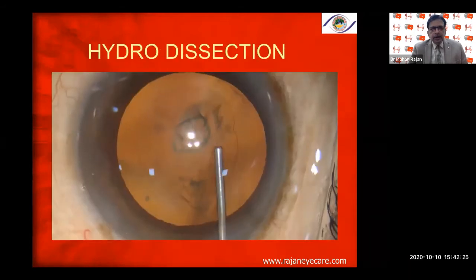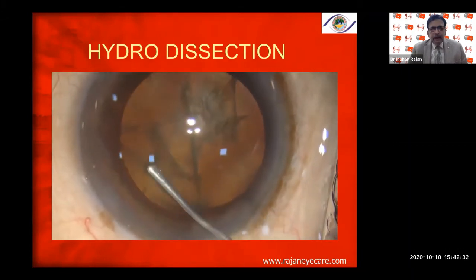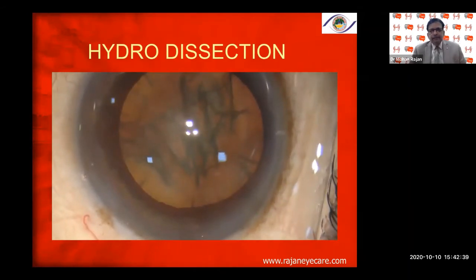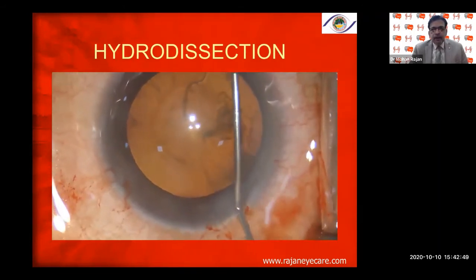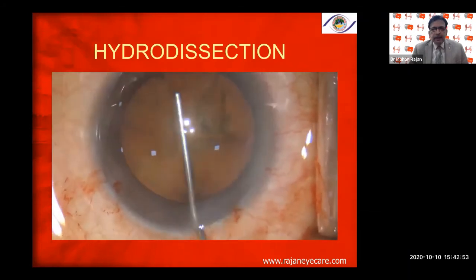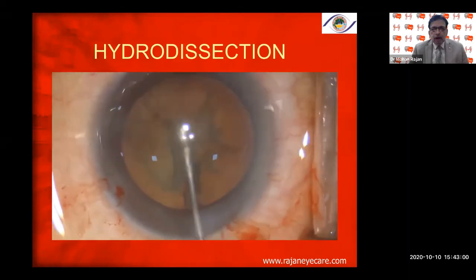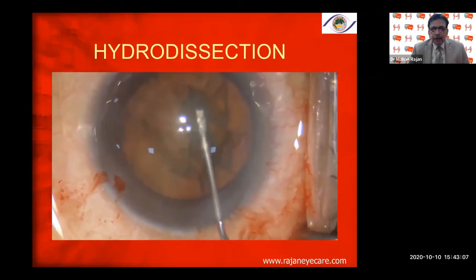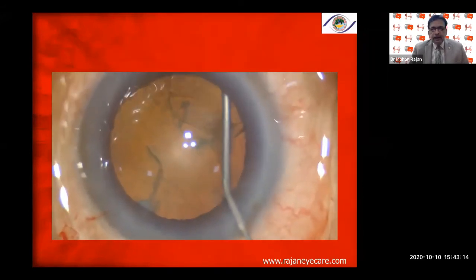Here you can see hydrodissection in progress — going underneath the anterior capsule, injecting one wave, decompressing the nucleus, then going to another quadrant. Every time I decompress the nucleus back, I see the wave, and once you rotate the nucleus, it starts rotating freely. In another patient, I go underneath the anterior capsule, create a tent, inject in one stroke — every time you decompress the nucleus, don't forget to do that. Go to another clock hour and inject one stroke, seeing the nucleus come forward each time.